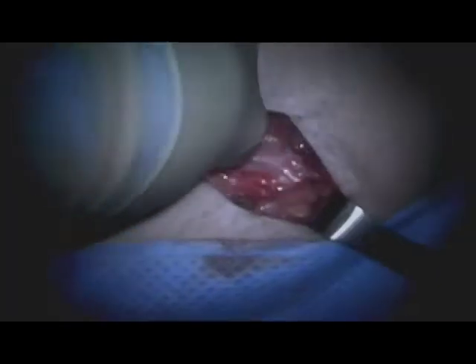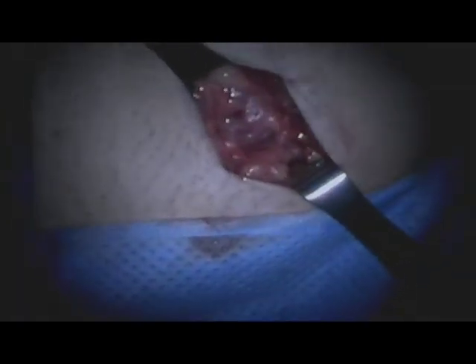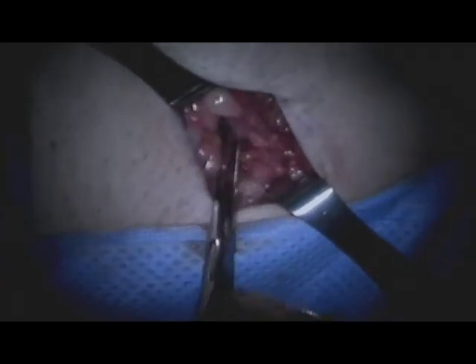The tissue above the spermatic cord is then gently retracted. The assistant then places tension on the testicle, allowing for visualization of the spermatic cord. Once the spermatic cord is identified, a Babcock is used to gently grasp the cord and deliver this within the surgical field.